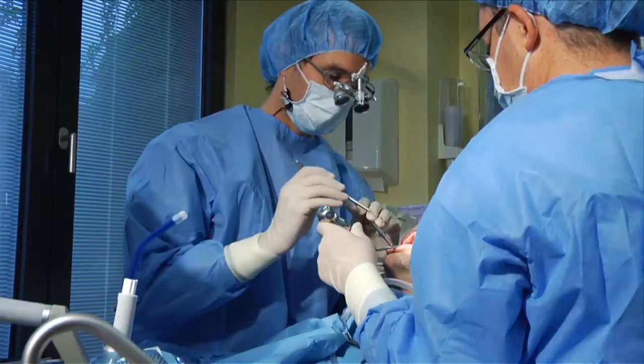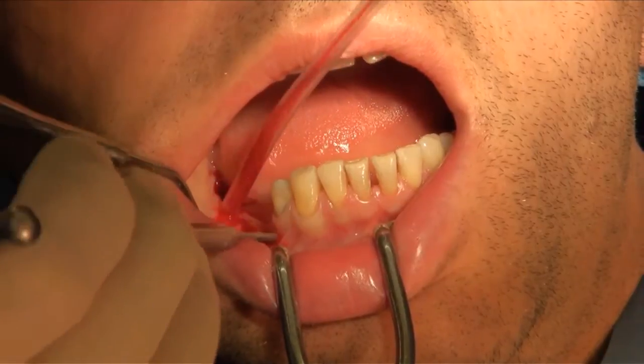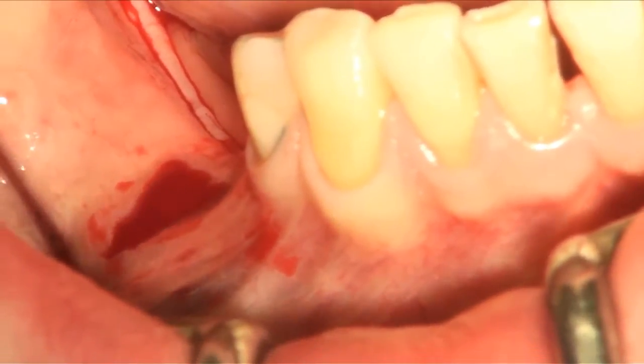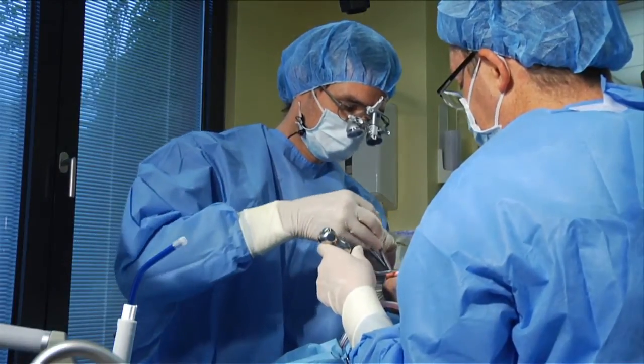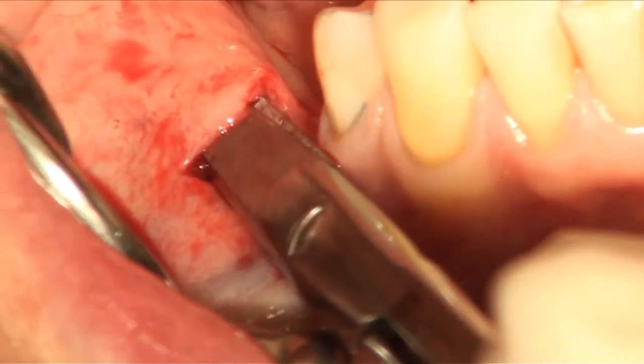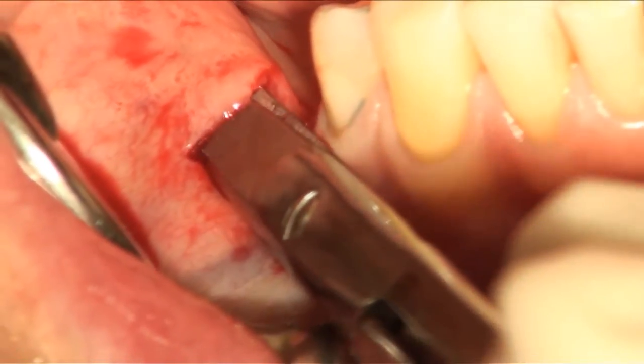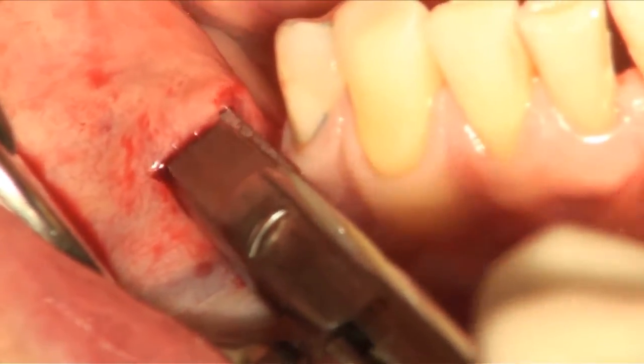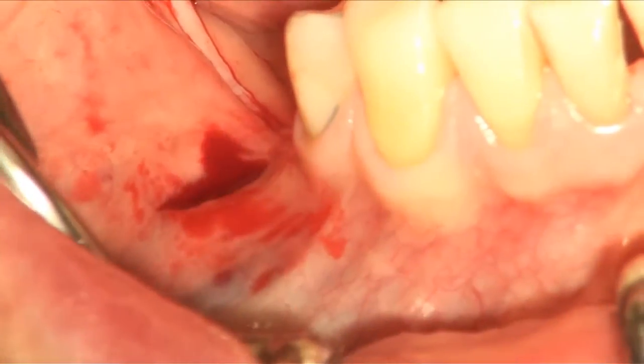Finally, we check the preparation using the surgical template. Now we have a fine and elastic pouch above the periosteum.